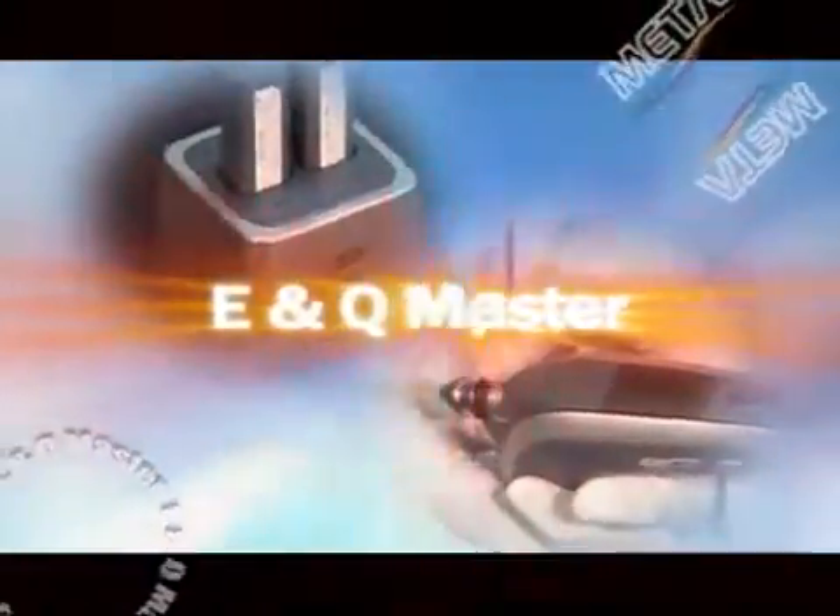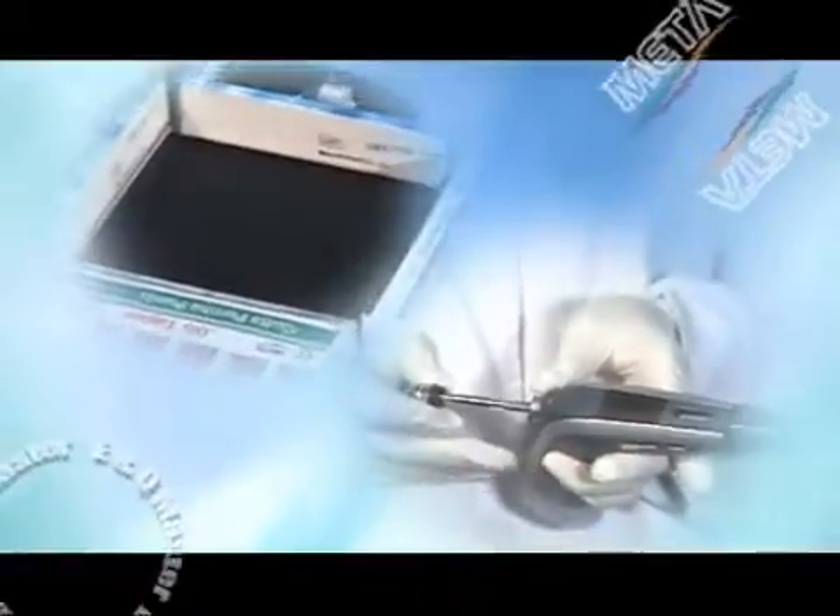MetaBioMed developed the first battery-removable cordless Gutta-Percha obturation system, the E&Q Master, in the world. This product was verified by dental specialists.